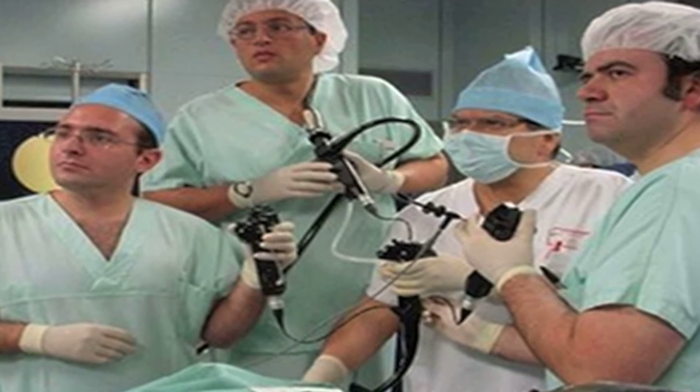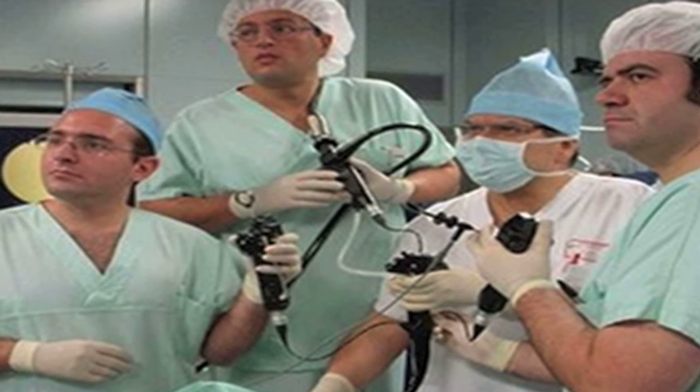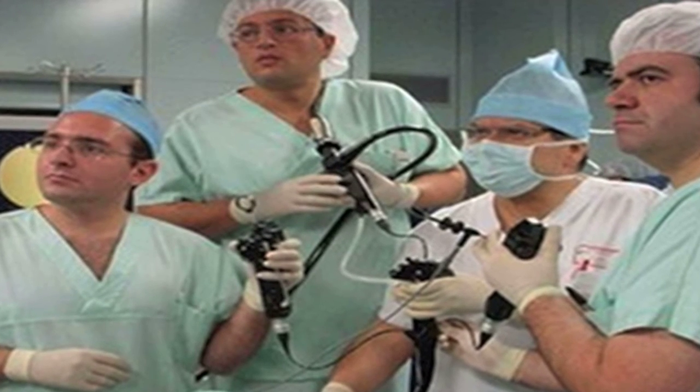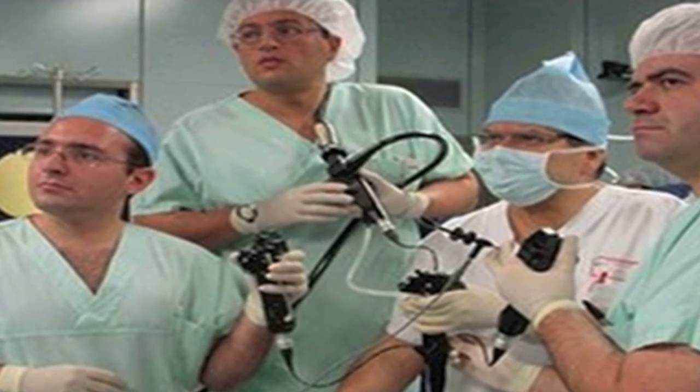Unfortunately, multiple physicians are required to control the endoscope and the instruments. This is undesirable because optimal coordination is required, which is very difficult. Furthermore, this is very costly.